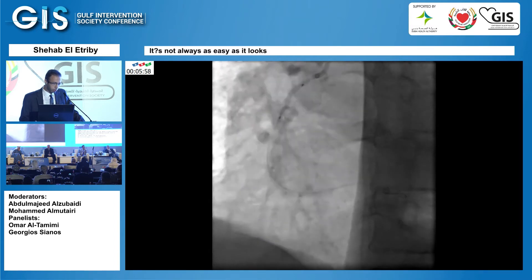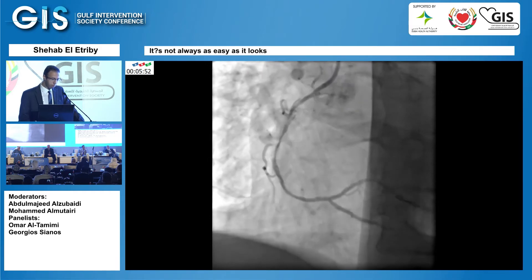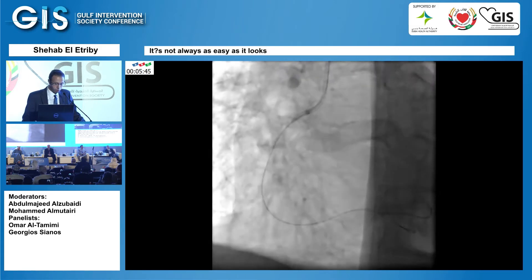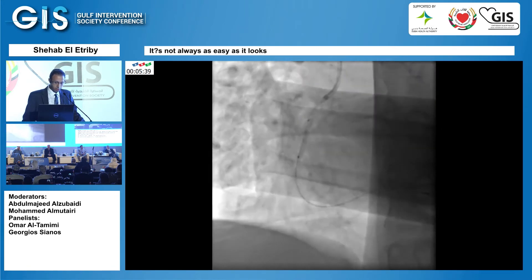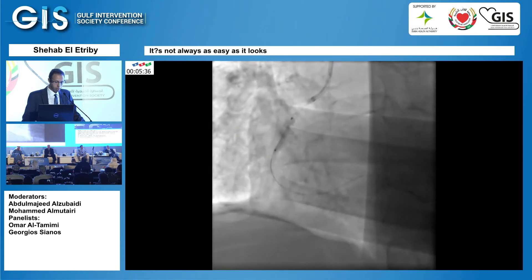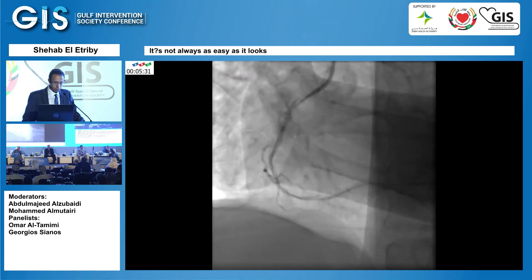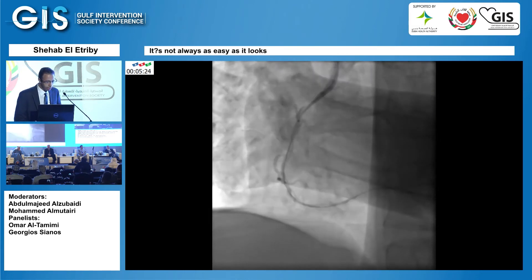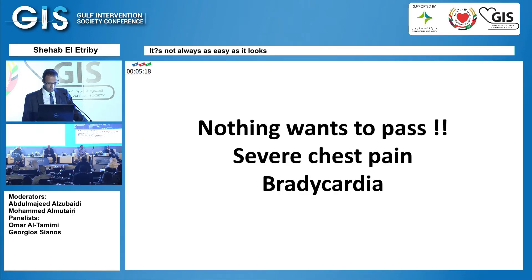As you can see, the balloon is not uniformly inflated. The problem is it created a large dissection flap and I couldn't pass it anymore. I put another buddy wire, which also failed. The 2.5 balloon passed again and I inflated it, but the stents failed to pass. The view showed extension of the flap proximally and distally, creating a spiral dissection up to the posterolateral branch. Now nothing wanted to pass — severe chest pain, bradycardia.